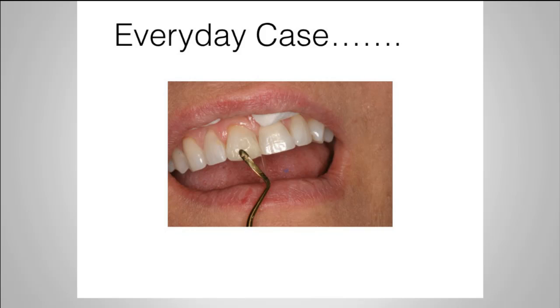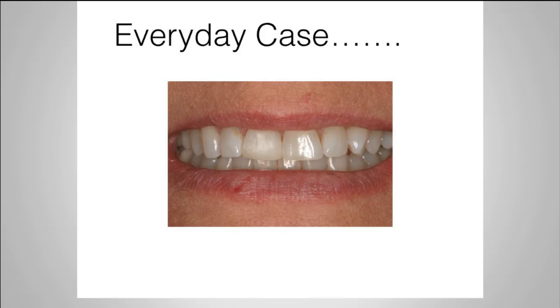Okay. Then after that, I went ahead and light cured and everything, and then I layer my composite. This is a straight A2. Okay. It comes in various shades of an A2E, an A2D, some extra light, a lot of components that will help cover a lot of your Vita shade gamut, by no doubt. But as you can see, I began to layer that and build that into the necessary areas that we wanted. This is prior to polishing, with a little bit of contouring.